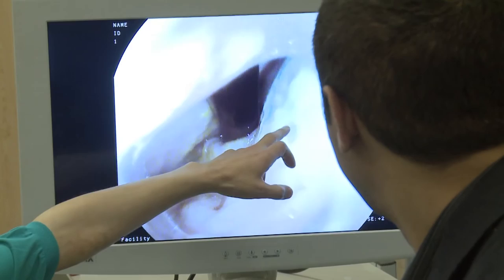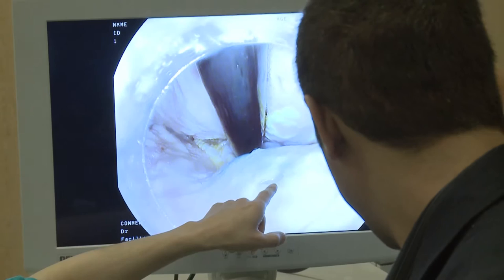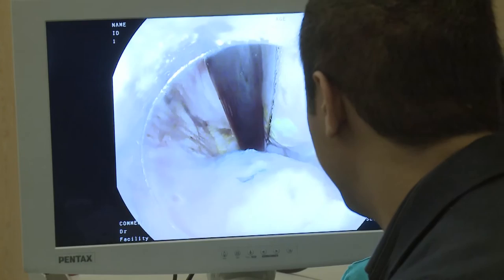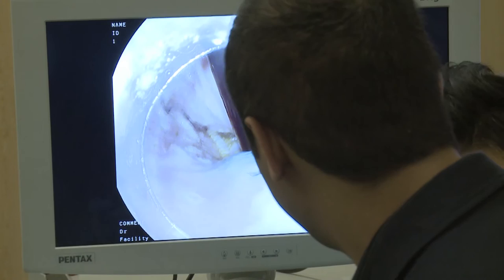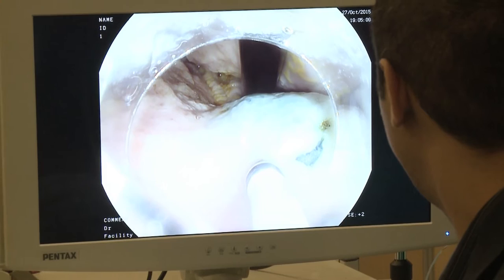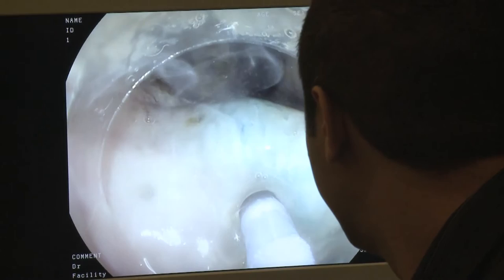Okay, start in this region. Here is a marking, and it is already injected. Start from here and cut. How many cases have you ever performed? Only one. How many models? Several, a couple of times. The first incision, here. Okay, start and cut. Yellow is cut mode. Cut. Just a moment.